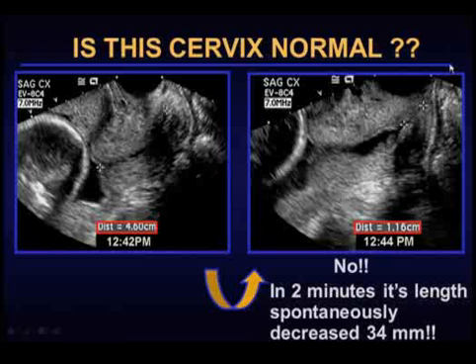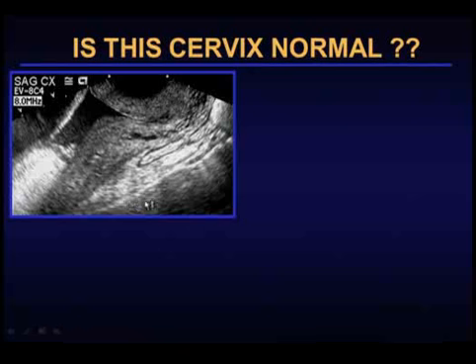Talk to the patient, try to get her to relax, and see if you have a more physiologic appearance to that cervix. Because when you first put the probe in, I think the doors slam shut, and that is something you don't want to have, a normal looking cervix if it's really dilated. So you want to pick up all the cases you can.